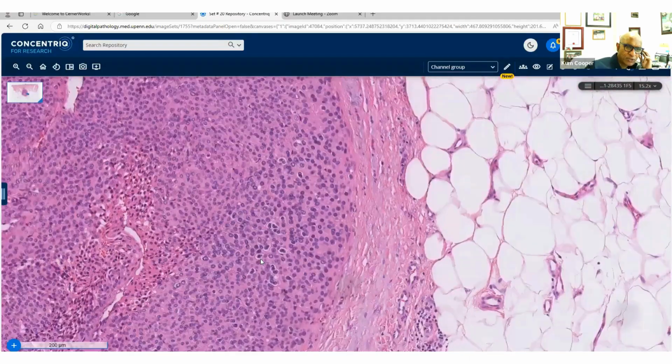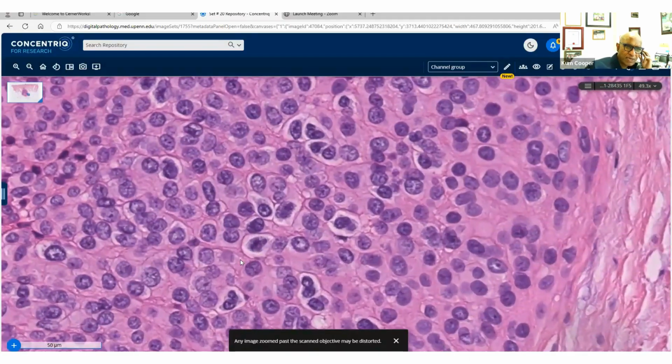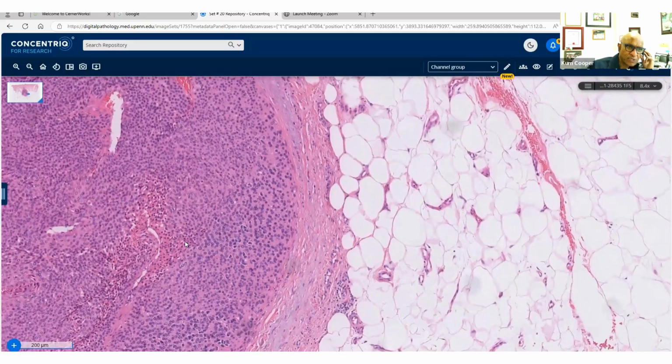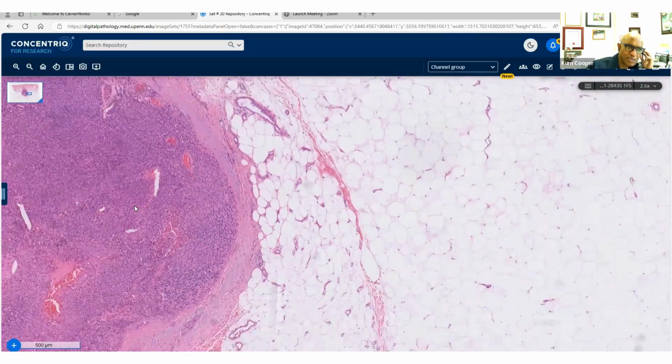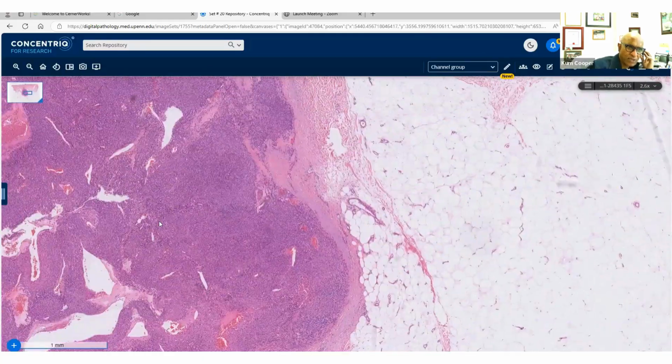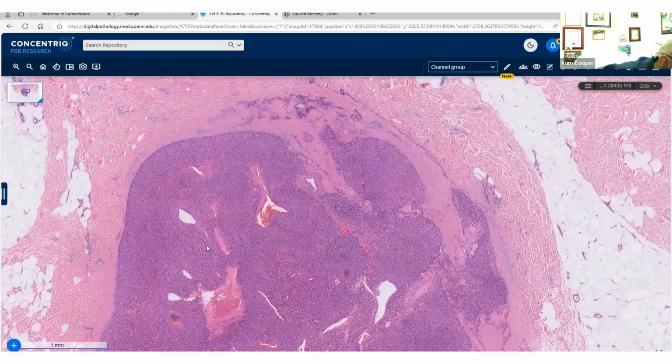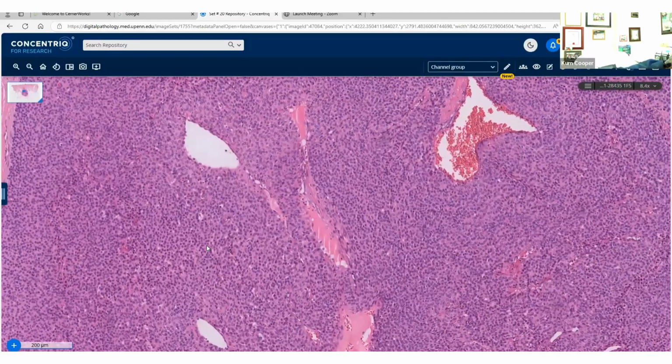And that's the reason for showing you this, just to bring up the conversation about when is a glomus tumor malignant. We see many of these in the skin of the digits, the fingers and toes. Some of them are in the proximal arms and legs. This one was in the buttock, and this is what we called it. It was shown to me by my colleague in dermatopathology, George Shu, and that's what we agreed to call it, an atypical glomus tumor. Any questions on that? Comments?